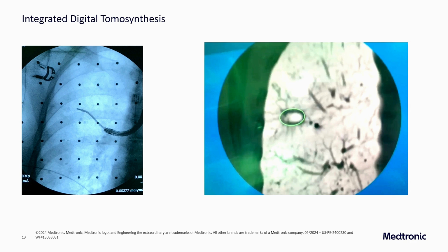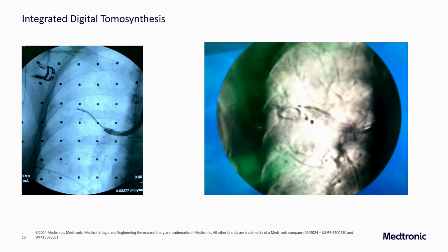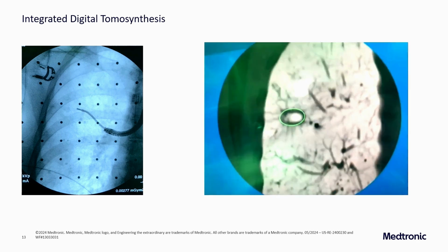It's not the digital tomo, but I'll play the video here so you can see the corresponding image with digital tomo, if it works. Here it is. I'll play it again. Right there. Not all that different. And that's fairly standard for what we see with digital tomo. Again, it's not a CT cut. It's not nearly as good, but it's good enough. You mark it, and then the system's like, oh, okay, this is where we need to go. This is where you need to steer your catheter toward. So we started using this in 2018.